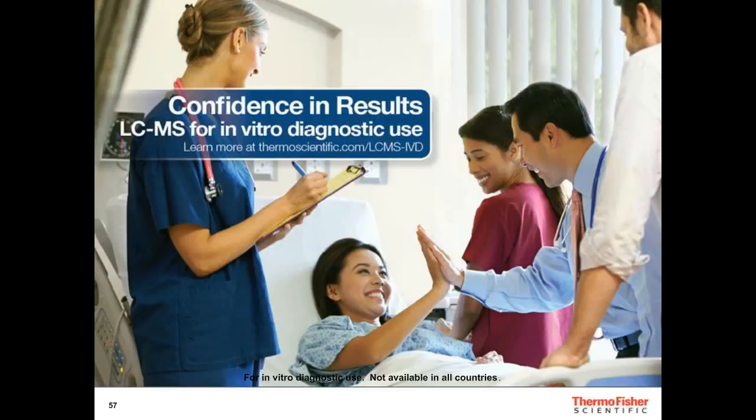Can LIMS interact directly with ClinQuan MD? Currently, in the first version, there's no direct link, but we can export or import the file into ClinQuan MD.